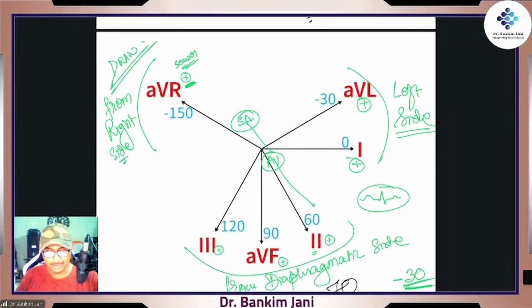But electrode-wise, it is positive. Positive means this is the eye. We are watching from here, our eye. Someone wrote that very clearly: the side from which we are watching will always be positive. So you can say this positive one is our eye. But this poor eye is crying, because everyone is going away. So that's why it will make the reverse ECG. The entire ECG will be completely inverse.